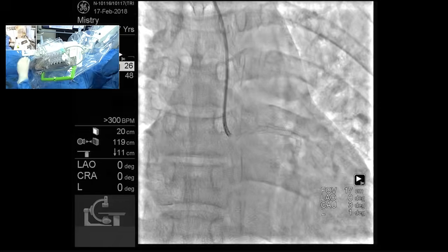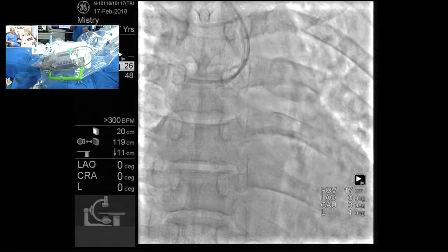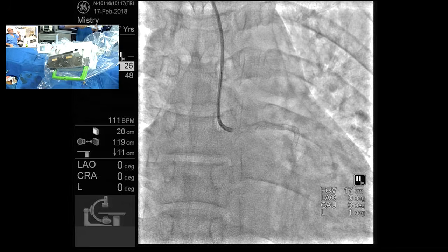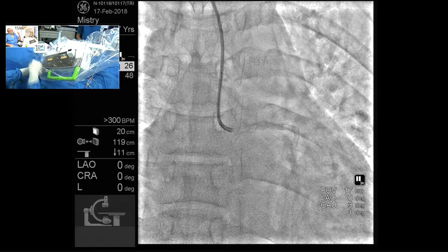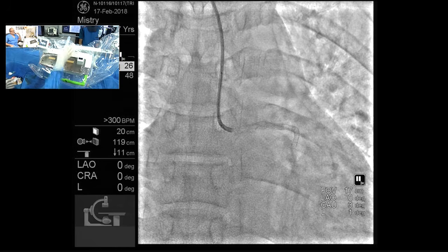So how comfortable are you controlling them from this remote knob? Are you feeling very comfortable, or are you still hesitant and carefully operating the instrument? Good question, good question.